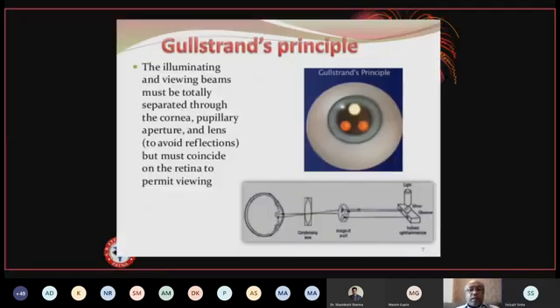For the postgraduates, I know this is a DNB question. They have asked a short question once in a while on the optical system of indirect ophthalmoscopy. We being biology-based, medical people, physics, rays of light, convergence, divergence through lenses are not our cup of tea. But as ophthalmology postgraduates, this is expected of you. You will get this asked once in a while, even in spotters, even during viva. Sometimes you will just be given the 20D lens and asked what kind of lens this is. They do deviate to what are the intraocular lenses. Sometimes they can ask you what is the 20 diopter lens, how does one use it, what is the principle behind it. So you should know this name and the drawing that Dr. Pooja has shown over here. The next slide, please.